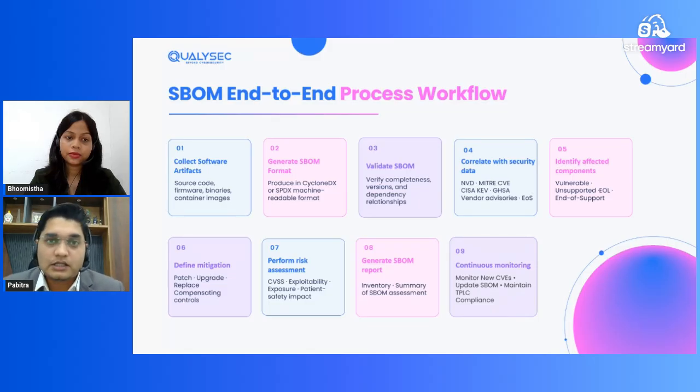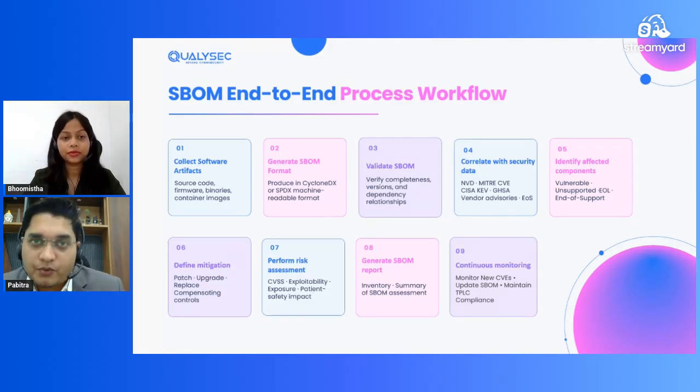It's not that it's a single page or a static report. You have to continuously monitor what new vulnerabilities are affecting our components in the coming months, and how we can make it secure. So this is the whole complete process.